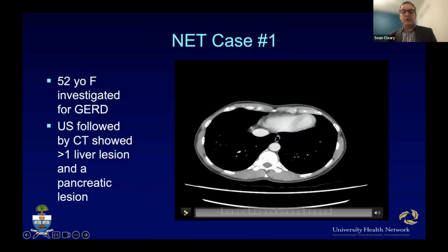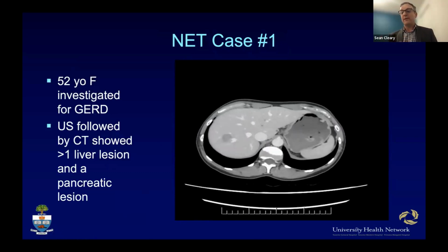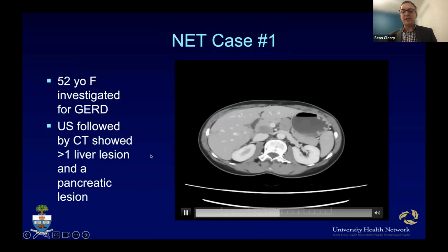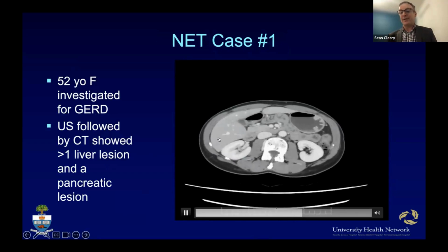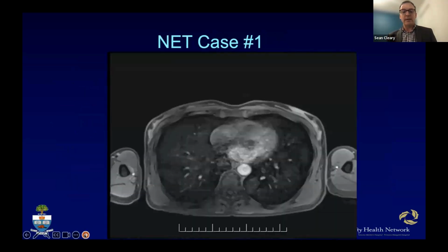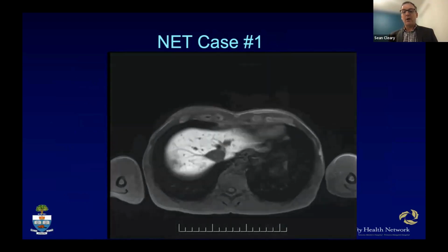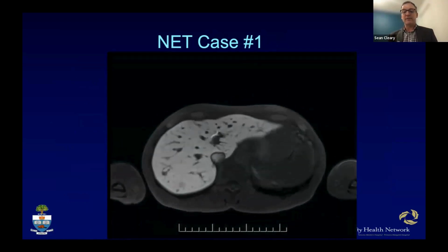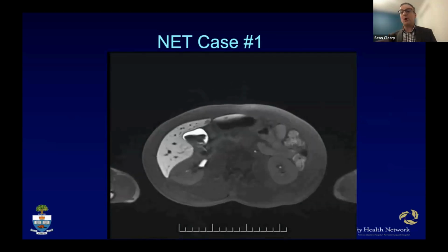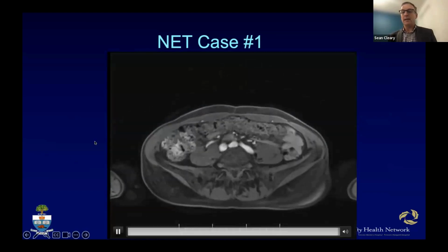And again, Kartik alluded to neuroendocrine tumors. This is an area where we can be particularly aggressive with resections, and we can resect up to 30 to 35 lesions and significantly prolong the survival. I actually think that CT is not very good at finding these lesions. What we've realized now is that with the utilization of Primovist MR, our ability to detect and delineate these lesions is far, far superior, particularly in neuroendocrine tumors, where they tend to have multiple small subcentimeter lesions that tend to be missed on CT.